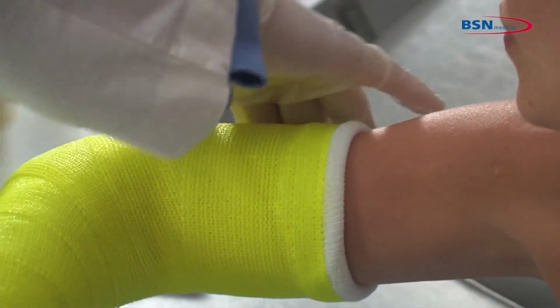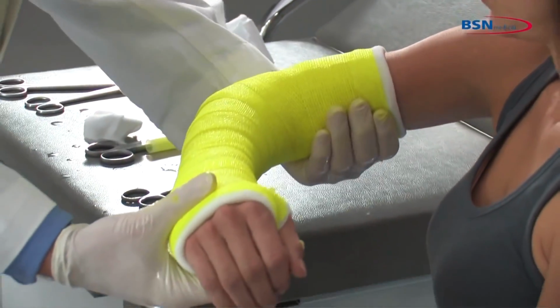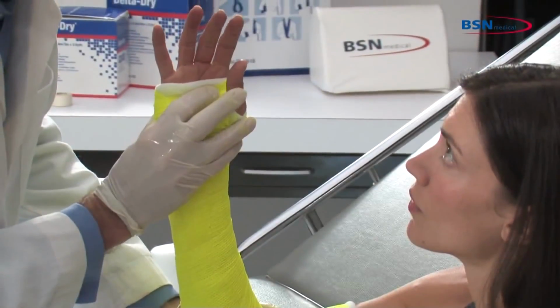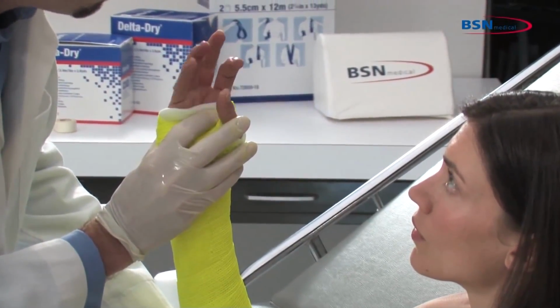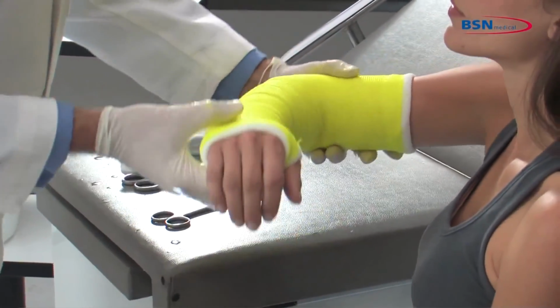Be sure to leave approximately 1/2 inch of stockinette exposed to leave a soft end. Mold the cast with the palms of your hand. Check for any limitations in range of motion. Check for any pressure points that may cause irritation. And you are finished.